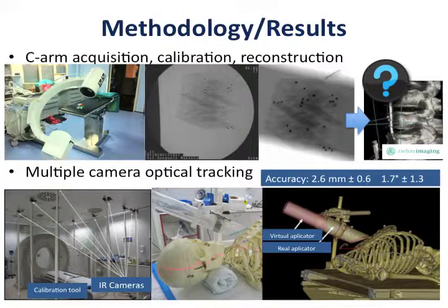The other area that we are working at is surgical navigation. Since the scenarios are complex and there are several users there with occlusions and so on, we are using a multi-camera system with 8 cameras.